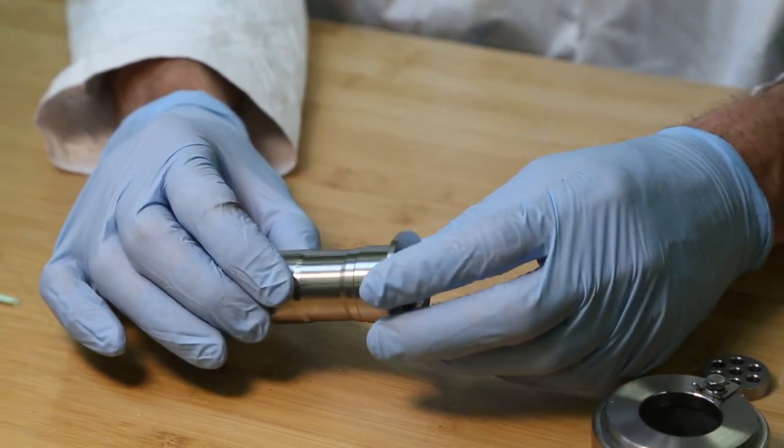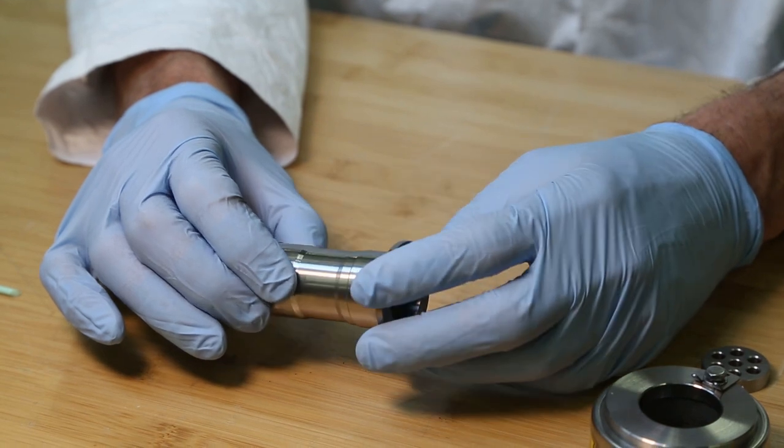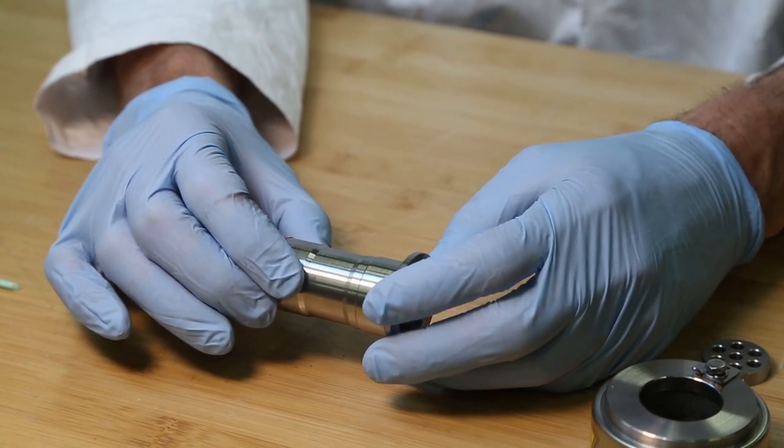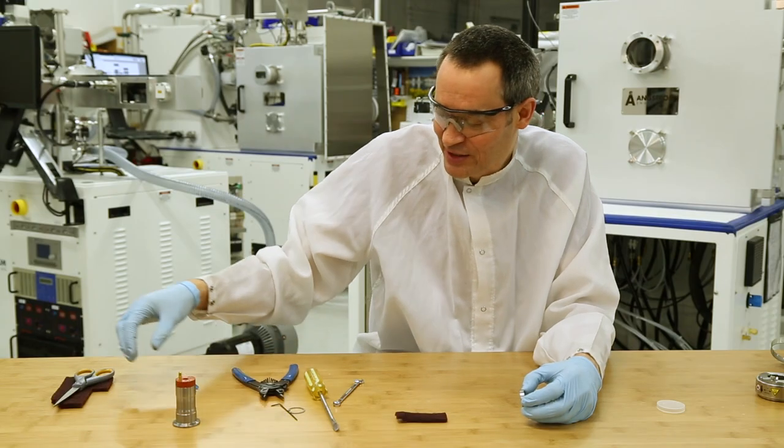I'll do the fasteners up snug. And that's it, and we're ready to put the pole piece back in and finish the assembly of the gauge. I'm going to set that aside.